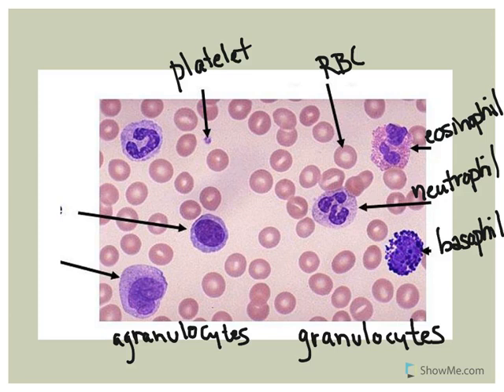The eosinophils have those dark red granules, and the nuclei are dark and usually bilobed. With the basophil, when staining the granules, it's almost impossible to see the nucleus. The nucleus will be present if unstained, and will have a large bilobed or even kidney-shaped nuclei, but with this stain it's being obscured — you're just seeing all these blue dots.